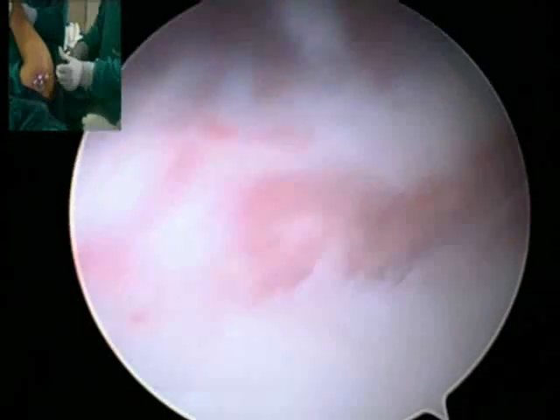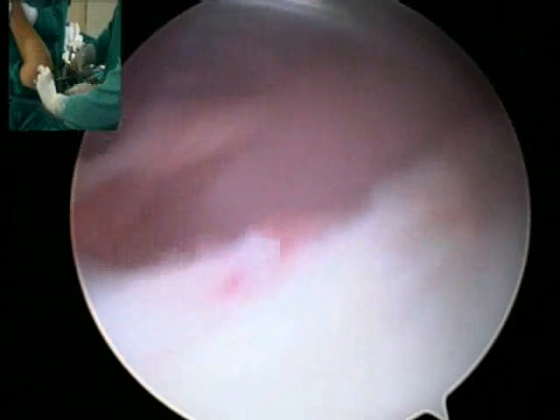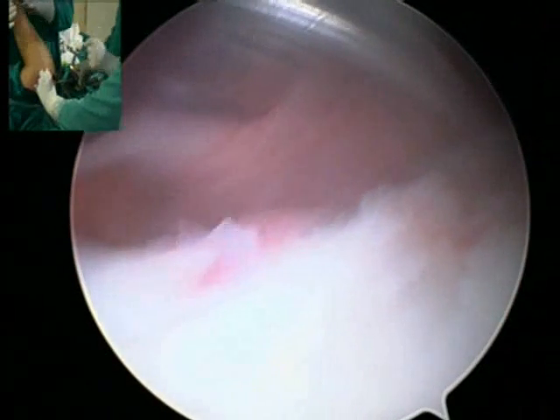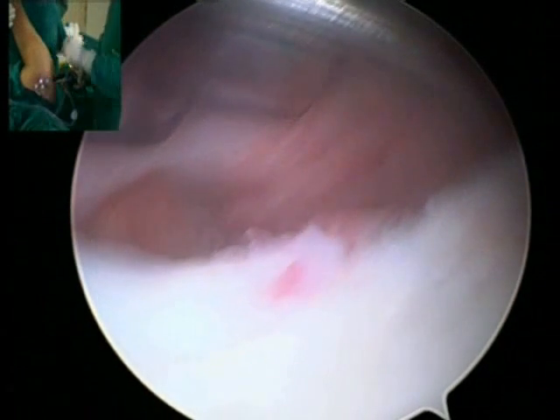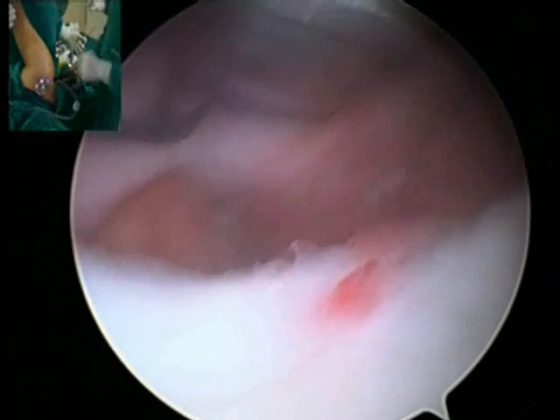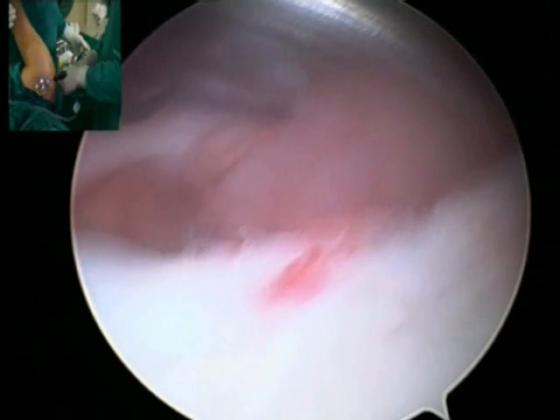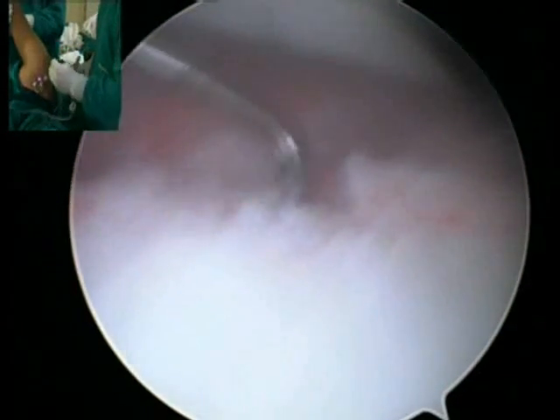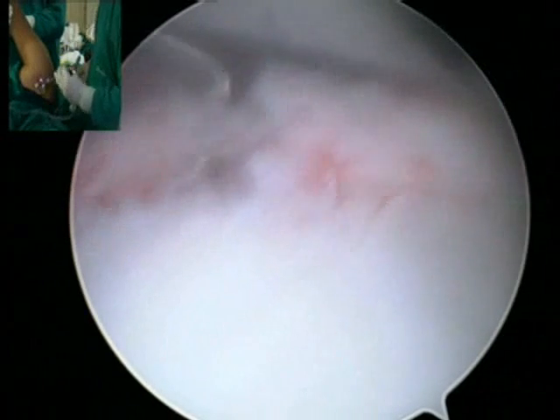Right. What I'm going to do is start with my first anchor. I'm going to use titanium 2.8 millimeter self-drilling anchors. Sanjay, do you normally prepare the rim of the glenoid? I have tried and prepared that, but with the curette and shaver which I have, I couldn't do much. So I'm going to accept whatever is here right now.